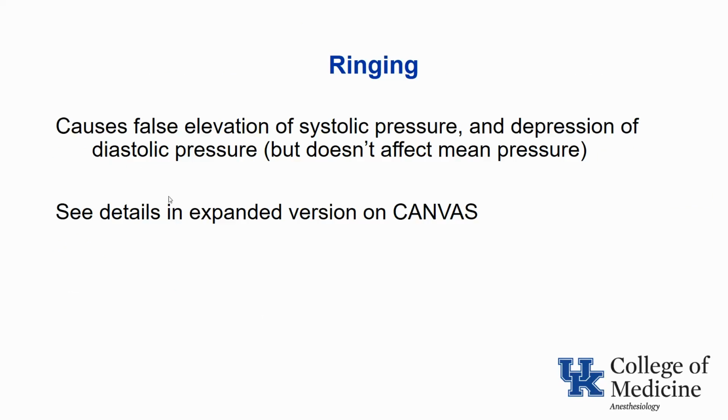As I emphasize, this causes false elevation of systolic pressure and false depression of the diastolic pressure. I strongly recommend that you review the details that I've provided in the expanded version on Canvas.